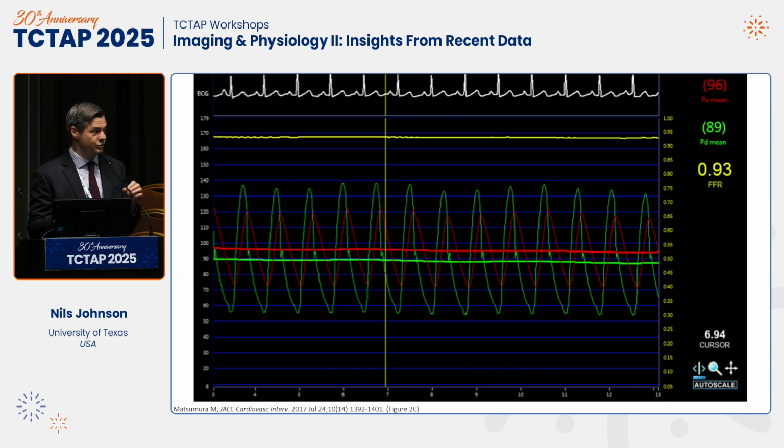So to go back to the tracing and explain what's happening, you'll notice a strange thing. That is, the coronary pulse pressure goes from whatever that is, 50 to 100 and something, but the red pressure in the aorta has a narrower pulse pressure, right? The top is not as high and the bottom is not as low. The second thing that's different about the red pressure tracing of the guide catheter is that it no longer has the typical shape of what we think of as aortic pressure tracing.